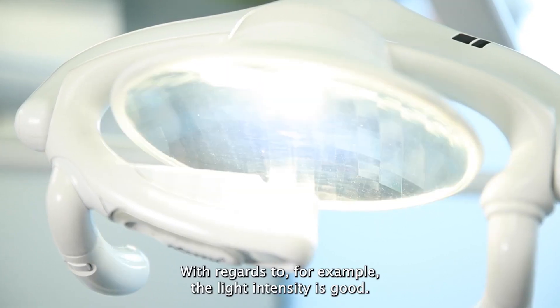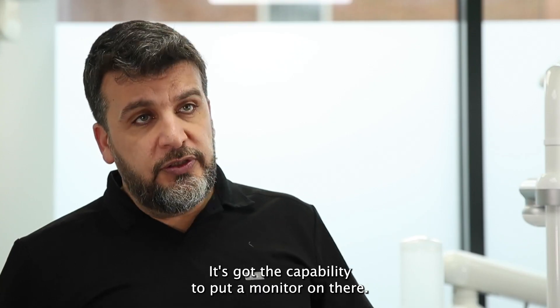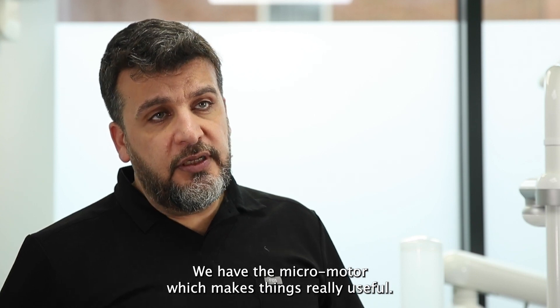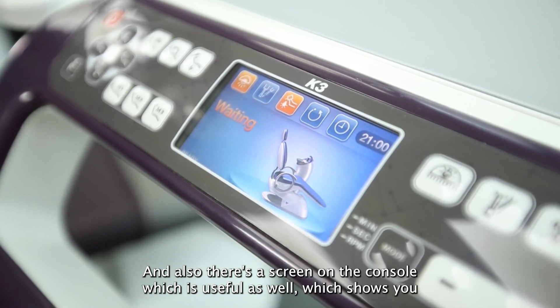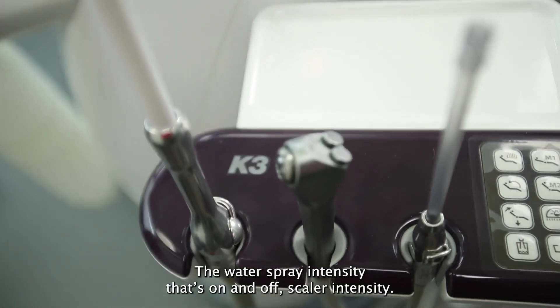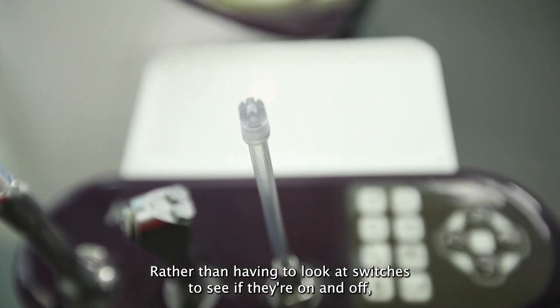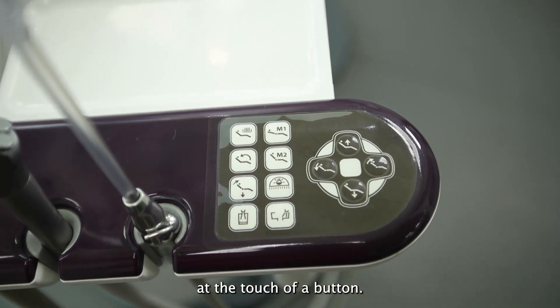With regards to the light, for example, the intensity is good. They usually come pretty fully loaded, which is good. It's got the capability to put a monitor on there. We have the micro motor which makes things really useful, and also there's a screen on the console which is useful to show you the kind of information you want to have at your fingertips — the water spray intensity, whether it's on and off, scaler intensity. Rather than having to look at switches to see if they're on or off, you can just look directly on the screen and everything's right there at the touch of a button.